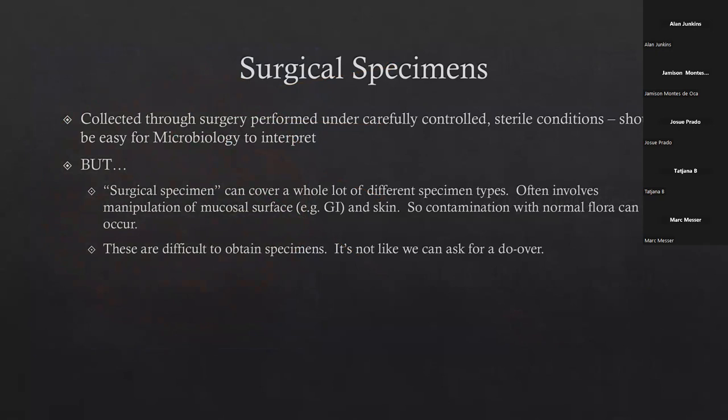Here's another problem with surgical specimens: it's a big range. Every single part of your body could be a surgical specimen. Even though we're talking about disinfecting the skin and cutting through to take something we'd normally expect to be sterile, surgery often involves manipulation of mucosal surfaces — the GI tract, the skin — so contamination with normal flora can occur, even in surgically collected specimens.